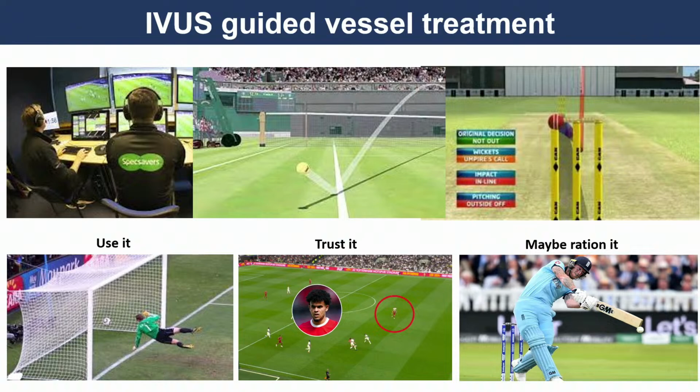And I think the idea that TASC A and B lesions don't need IVUS, maybe when you're first starting off, they're the good lesions to use IVUS on, because you'll have a nice healthy segment above and below. You'll treat your lesion and you'll decide whether you're going to spot stent it or not, and then you have a nice healthy segment to choose. I'm going to stent from here to here, and here's my sizes, and you're using IVUS really simply.